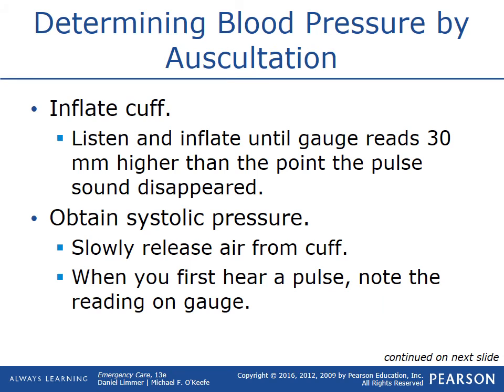Inflate the cuff. As the diaphragm's over, you're going to be listening the whole time, so you should hear that pulse. So you'll inflate that gauge until it reads 30 higher to where you quit hearing the pulse. So as you're hearing the pulse, keep pumping up until you don't hear it anymore, and then go 30 after that. Then slowly start deflating the cuff.